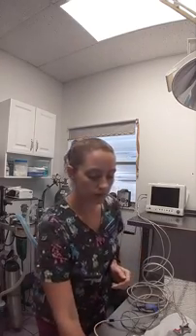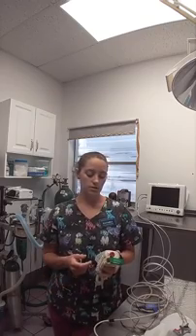Another one of our devices that we have is a thermometer. So you would take the patient's temperature and make sure it's in a normal range. While the patient is under anesthesia, the temperature can be anywhere between 97 to 102.5 degrees Fahrenheit. So you would keep monitoring it and adjust as needed.